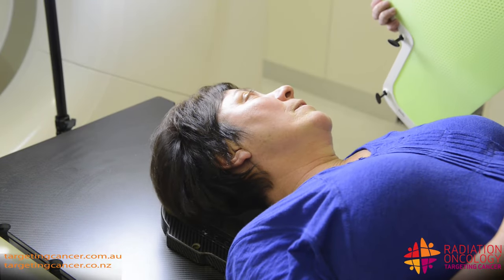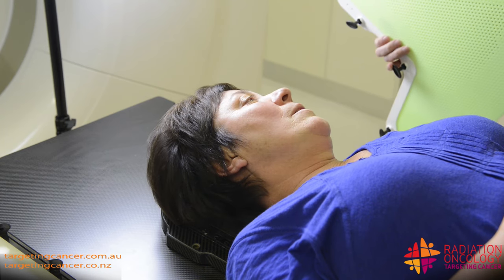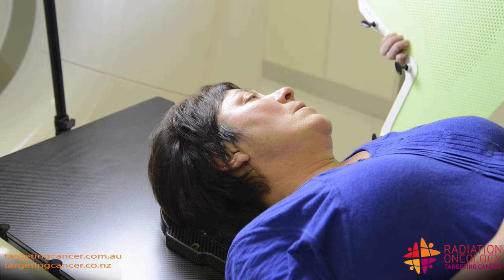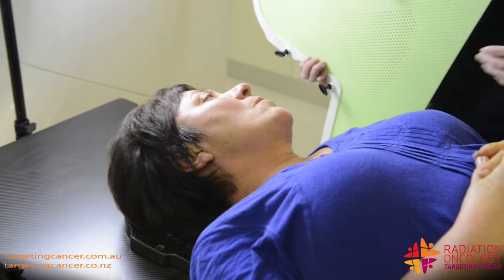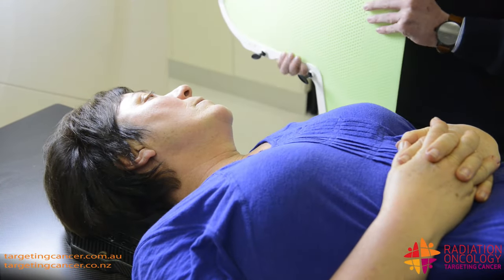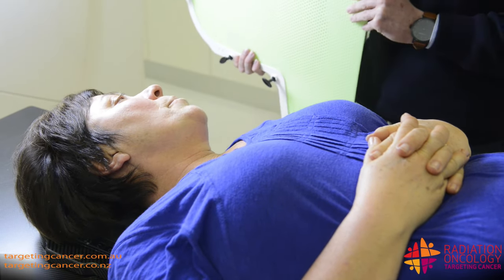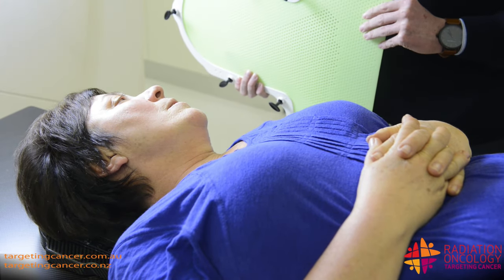Okay Julie, so this is a mask we're going to be making for you. I have to put it in the water bath — it'll be in there for a couple of minutes, it'll melt down and soften. We'll bring it over. It is quite warm and wet when it does come out — it's like a facial, that's what I've said. I'll put this in the water bath and get you nice and straight, all set up and ready to go.